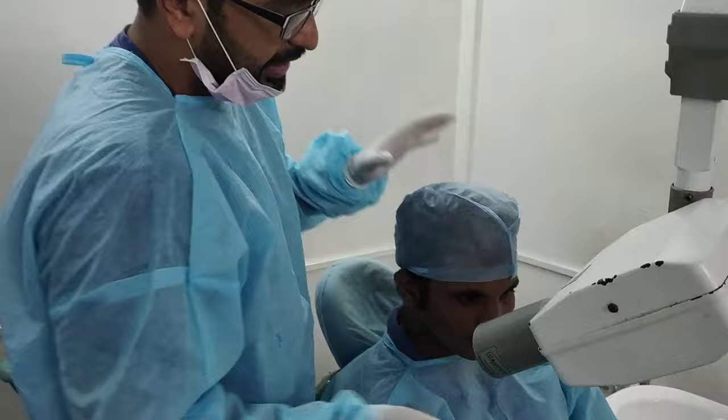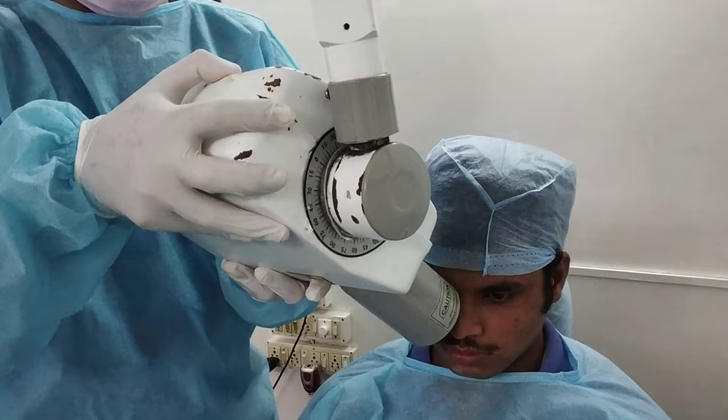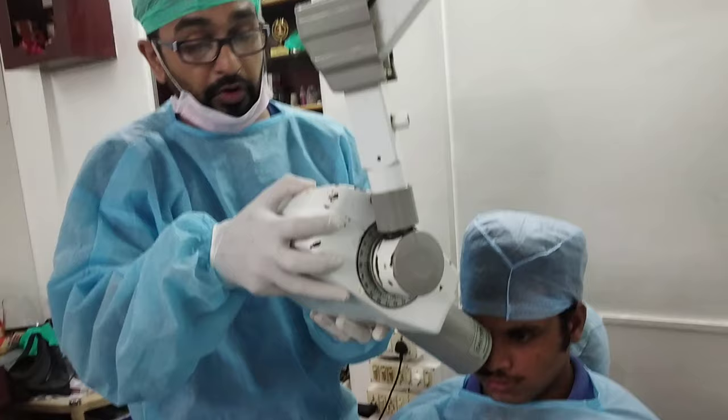Now if we come to the lateral incisor, the technique is similar to the upper anterior tooth — we just have to shift the cone more distally. So this is the approach for the lateral incisor tooth.